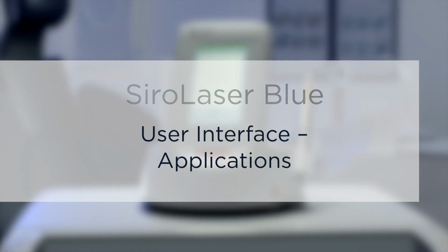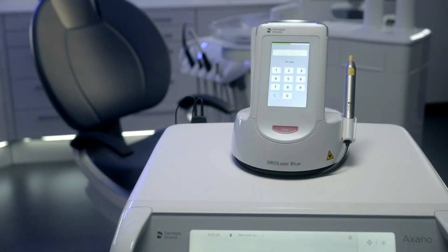User interface, applications. The SIROLaser Blue already contains a versatile range of preset applications, but also allows a maximum of individualization.